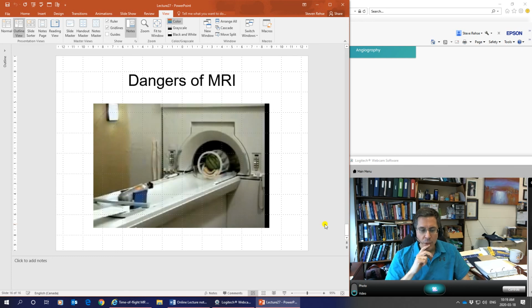As well, we worry about current loops, right? Because dB/dt is huge, and that's the flux. And the amount of current induced in a loop depends on the flux. So if you have any loops of wire in the body, there's going to be a huge electrical current. So when they put on the headphones, like I'm wearing a pair of headphones right here, if it had a loop in it, just like this laying on my side, this thing would start to generate so much induced current through it that a patient can get burns.